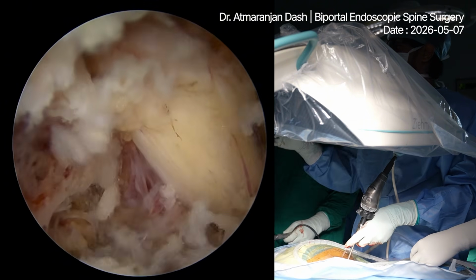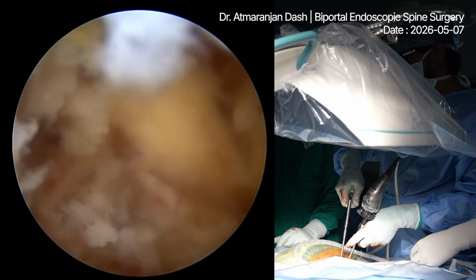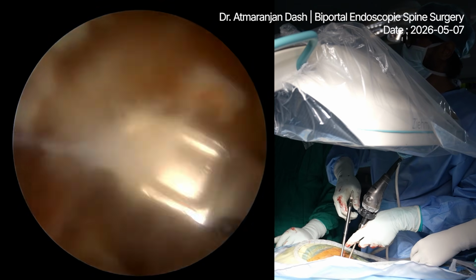So this is your pedicle. So you can see this is the pedicle. This is the pedicle. This area. Okay, this is the pedicle.